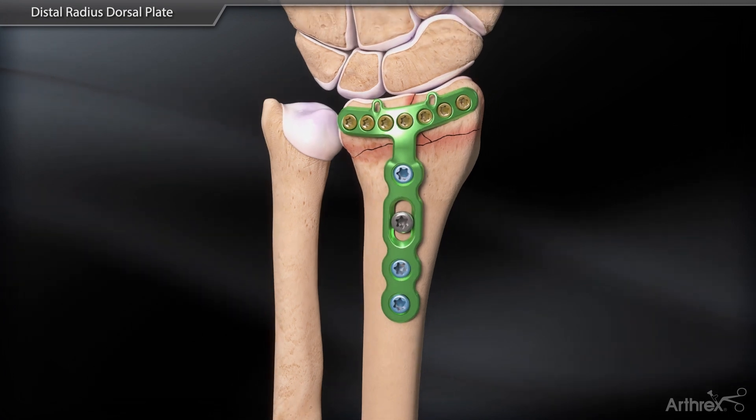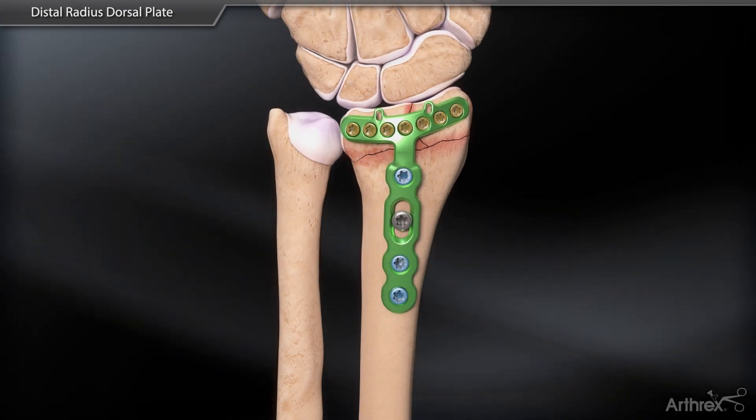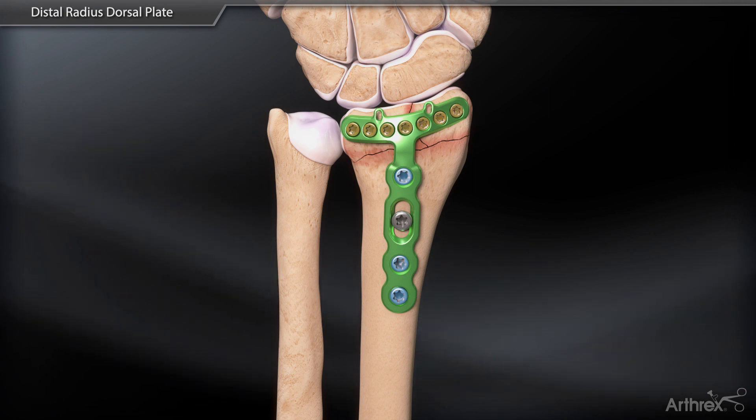the joint capsule can be reattached to the distal suture holes in the plate and soft tissue closure completed.